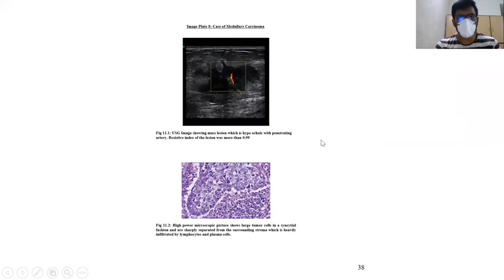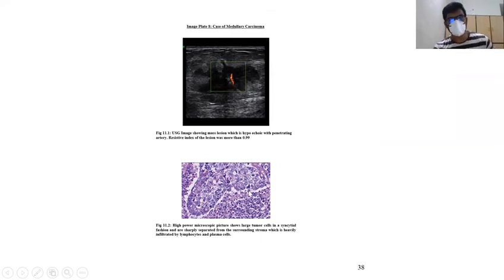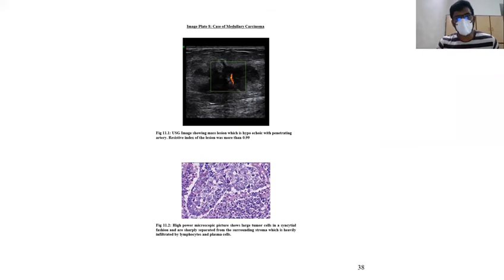This is a case of medullary carcinoma showing a hypoechoic lesion with a penetrating artery. Resistive index was seen at more than 0.99. The histopathological picture shows large tumor cells in syncytia, sharply separated from the surrounding stroma which is heavily infiltrated by lymphocytes and plasma cells.